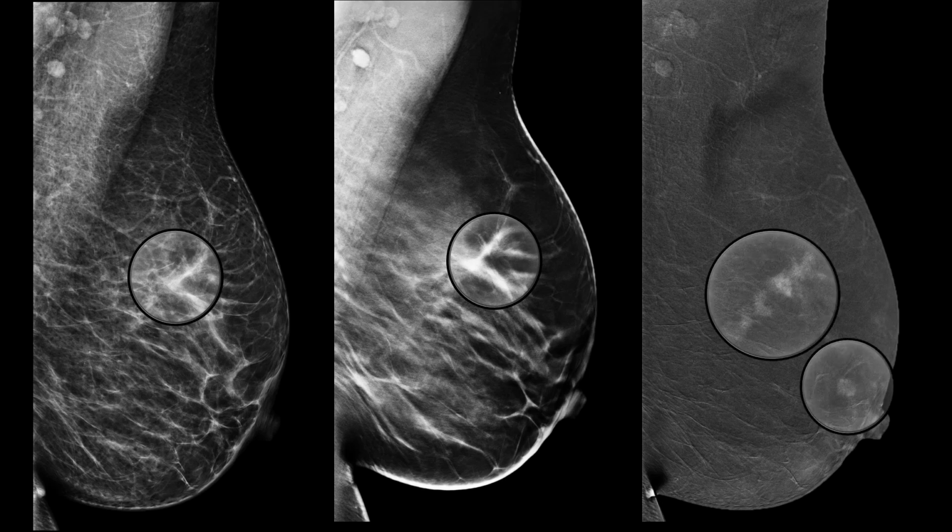And a surprise: not only is it bigger, but there is another one closer to the nipple. And this is not a dense breast. This patient, in a normal world, would never get an MRI. Nobody will tell me that she would have gotten an MRI with a breast like that. And surprises still. This is why we do contrast-enhanced mammography for all of our patients with breast cancer.